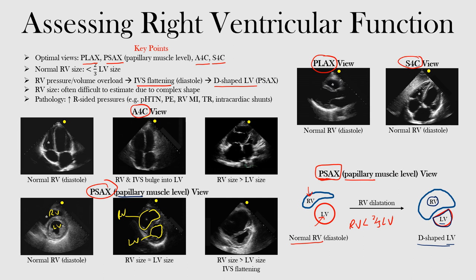Notice the size difference: the right ventricle is now bigger and they're almost actually the same size. In this third case, this is where we have severe right ventricular dysfunction. Notice the right ventricle — if I outline it — here's your right ventricle and here's your left ventricle. The right ventricular size is much greater than that of the left ventricle, and you have this intraventricular septum flattening.